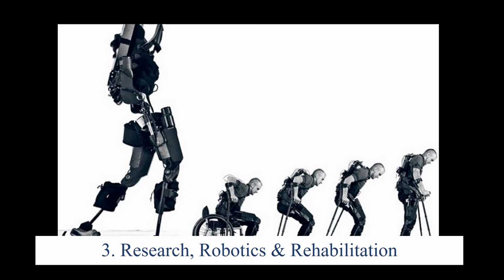Robot-assisted locomotor or gait trainers are now being used in some of the neurorehabilitation clinics, showing most promising outputs in achieving the rehabilitation goals. Studies show that non-ambulatory patients who experience robot-assisted gait training after stroke and spinal cord injury demonstrate an improved functional ability in natural walking. Besides the melioration, improved EMG signals, ability to bear more weight on foot, walking performance with more natural gaits, gaining walking speed, reductions in spasticity, and improvements in cardiopulmonary efficiency are also demonstrated.